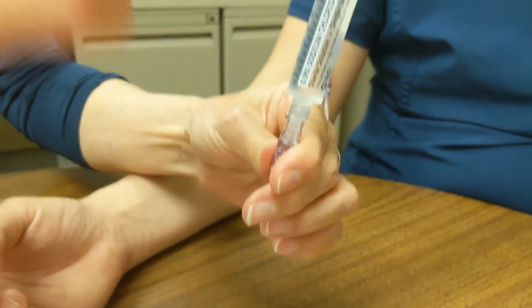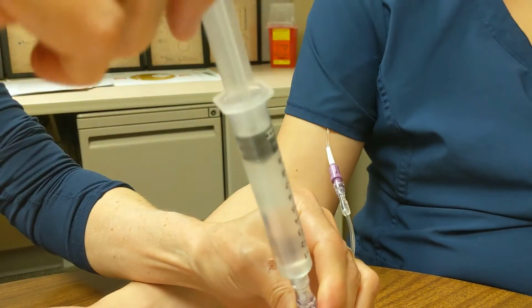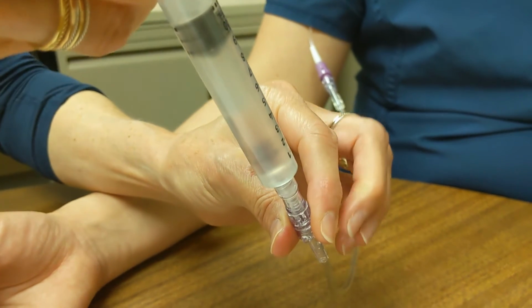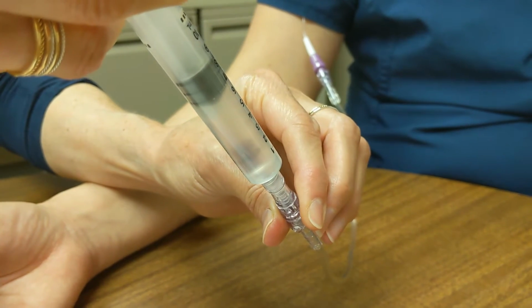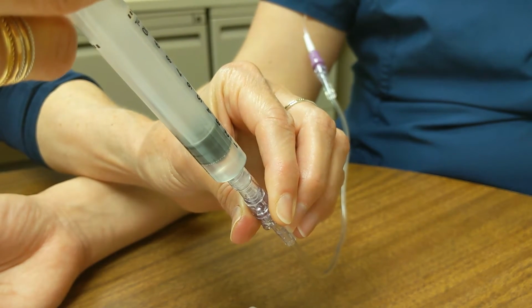If you notice air in the saline flush, tip the syringe with the plunger side up and tap the barrel with your finger so the air moves to the plunger end. Flush the catheter with 10 mL of saline. If you notice air, stop at the 1 mL mark, just shy of injecting the air bubble.